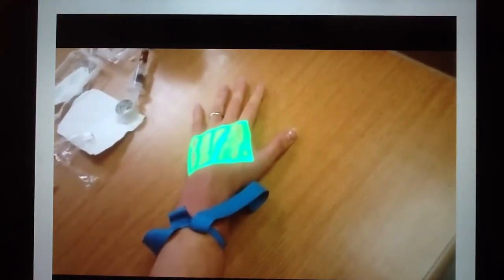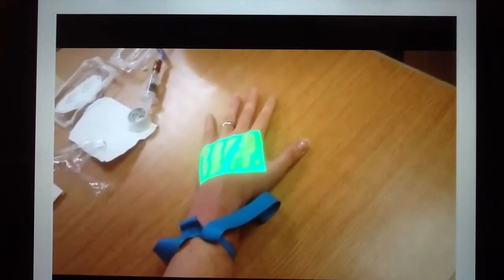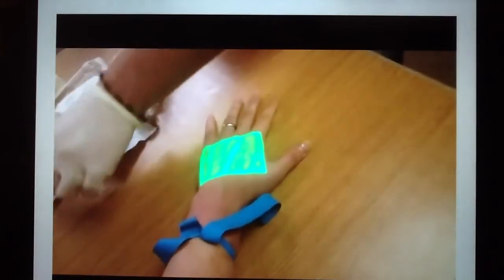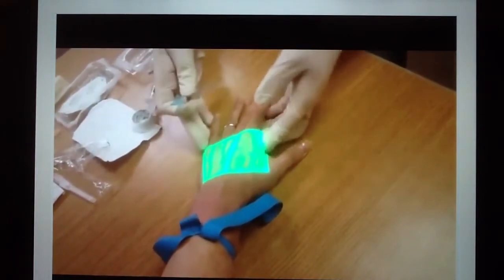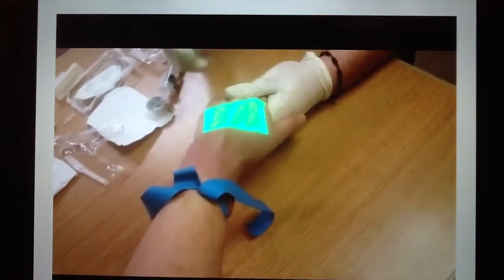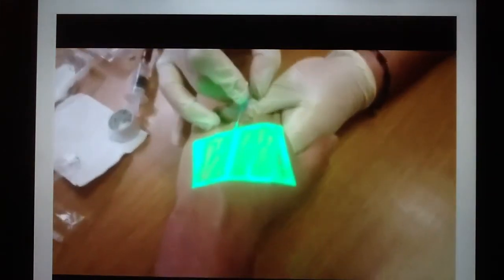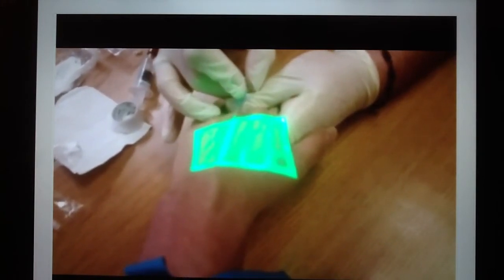I'm now going to show you a brief demonstration of the proper use of the VeinViewer Flex. The patient's wrist was tied off with a rubber band tourniquet and the machine was turned on so that I could see the near-infrared light on the patient's hand, which displayed his veins. I chose the largest vein on the patient's hand and palpated it, which showed good rebound. I then inserted a 22 gauge cannula into the patient's hand.